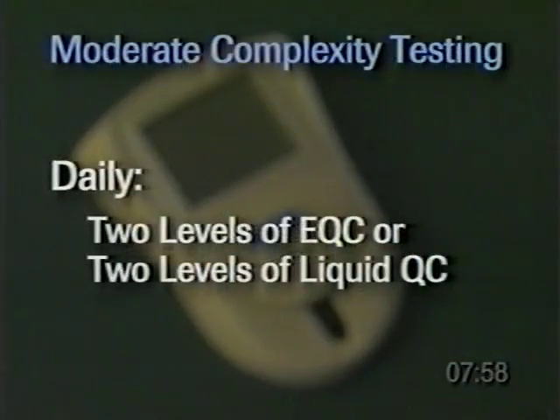The requirements for moderate complexity testing are different. In moderately complex facilities, 2 levels of electronic quality control or 2 levels of liquid quality control should be tested daily to assess the monitor's performance.